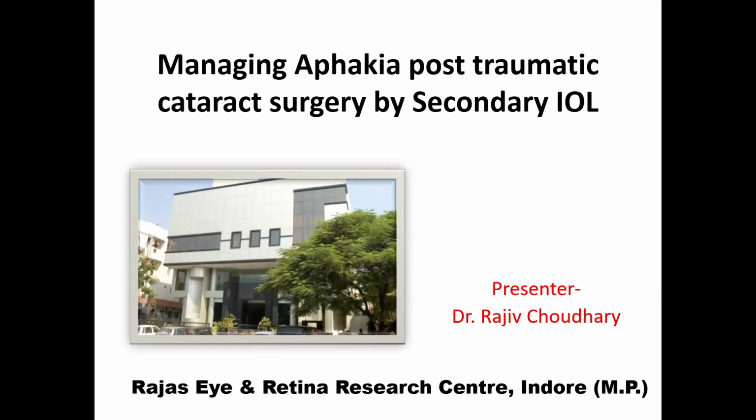Because we do only axial and coronal sections, we make the eye plane general, because sometimes the wound is also there. So a gentle, cursory examination is done, and in that situation it is missed. Later on, we should check it once the repair is done. We should do a B scan again, and then evaluate the posterior segment for any other foreign bodies.